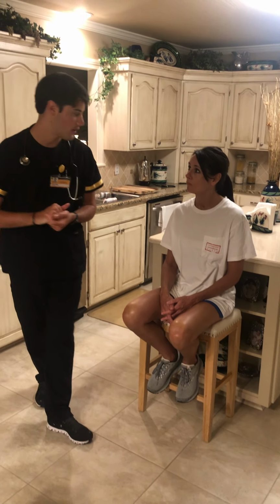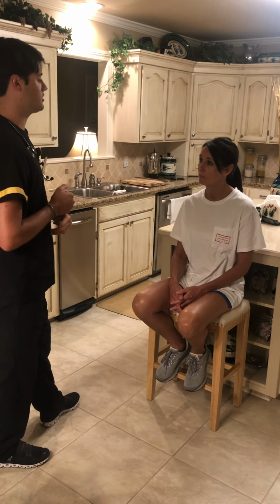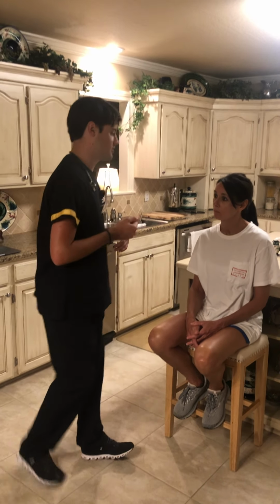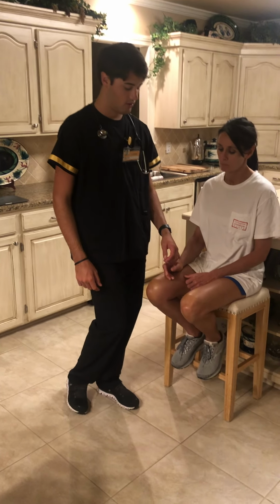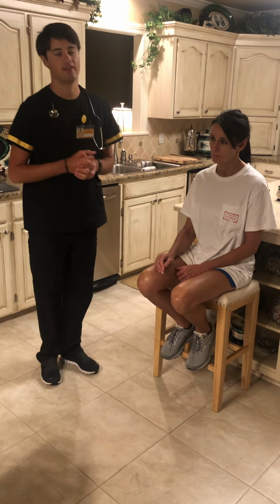So, done your temperature, check your blood pressure, check your respirations. I have checked your apical pulse. Now we're just going to talk a little bit about oxygen saturation. If I had an O2 sat monitor, I would stick it to the patient's finger, preferably with no nail polish on the nail. And that should be somewhere between 95 and 100.